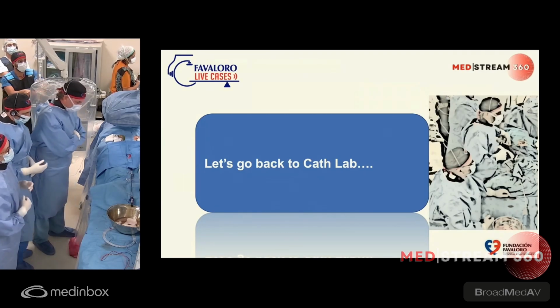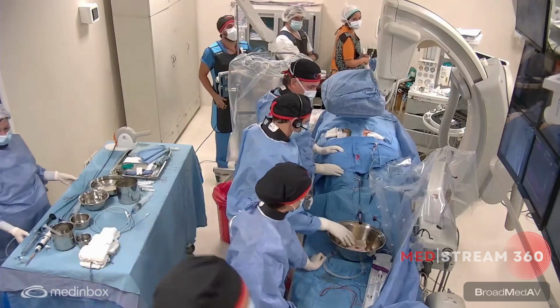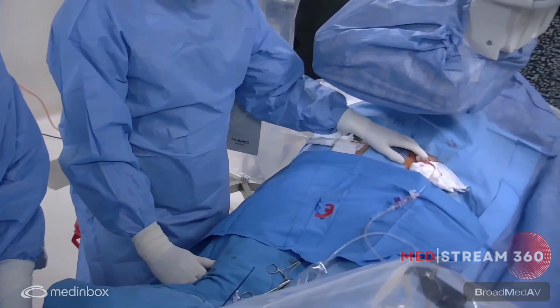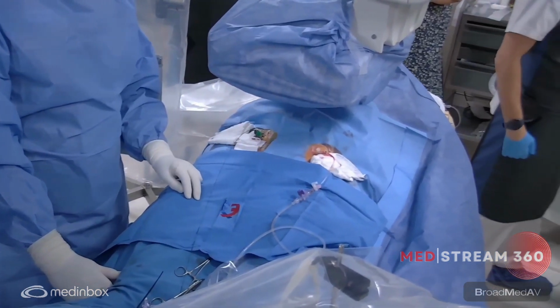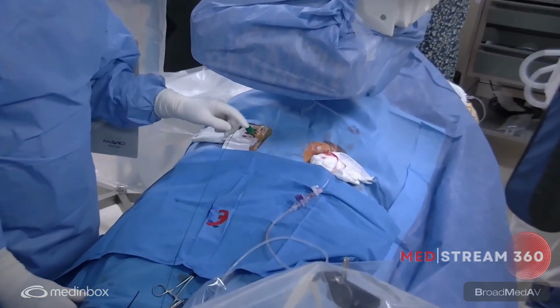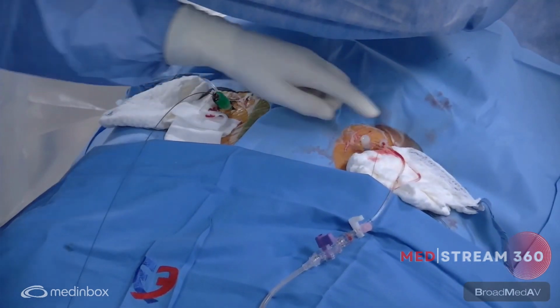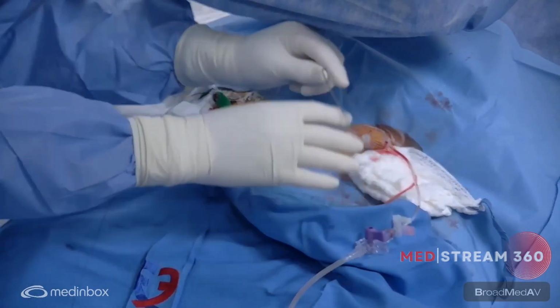So let's go back to the real life. We have already done the puncture on the left common femoral artery. So probably we can show you the angiography also too. We have a venous access here, and we have a crossover with the over-the-wire as always.